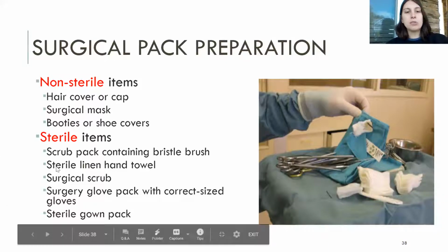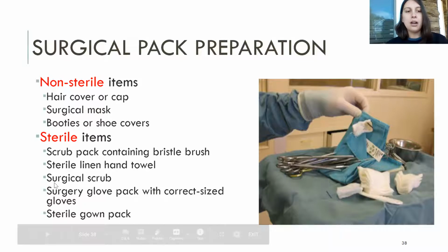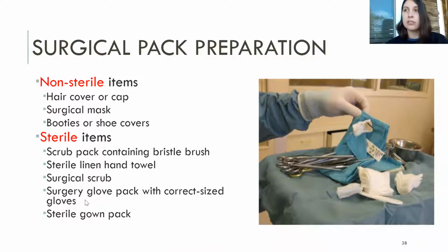The sterile items are going to be the scrub pack for doing the surgical scrub, the linen hand towel for drying hands off, the glove pack that has the correctly sized gloves, because obviously it's hard to work if your gloves are too big or too small. And then the sterile gown pack, which is what the vet was putting on.